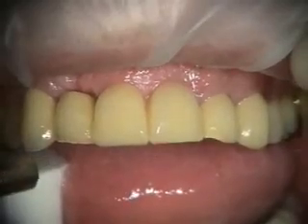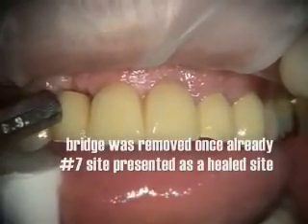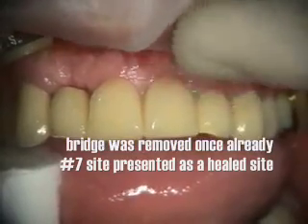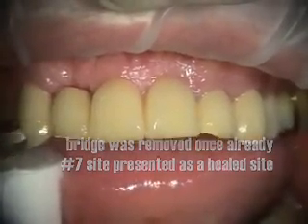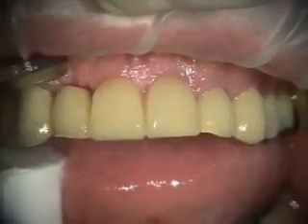Today the plan is this bridge from 6 — it used to be 6, 7, 10, 11. Now number 7 has been removed, so we're going to place an implant and take the bridge off. Then we're going to place an implant on the number 7 and number 9 sites.